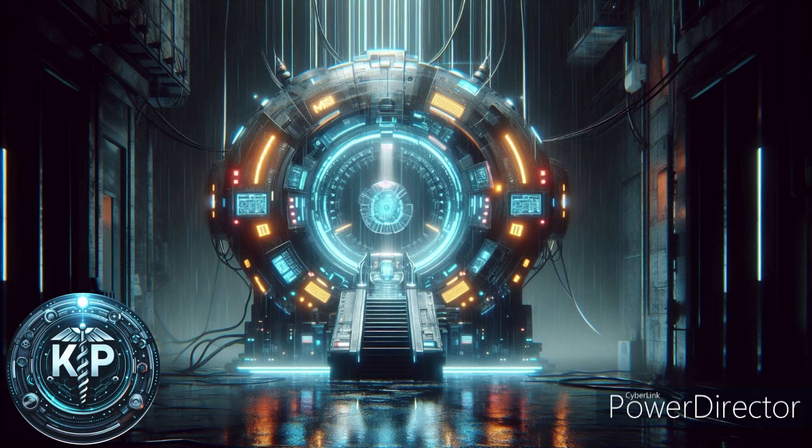Bore. This is the tunnel-like space within the magnet where the patient lies during the MRI scan. It's designed to accommodate the human body and is a critical part of the machine's structure. RF transmitter/receiver. These are part of the RF coils that transmit radio frequency pulses to the patient's body and receive the signals emitted by the body's protons in response. The quality of the images depends significantly on the performance of these components.